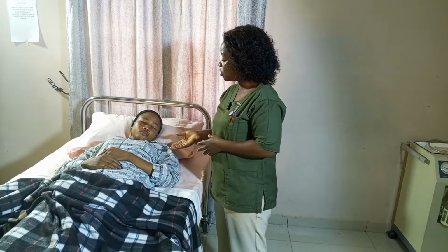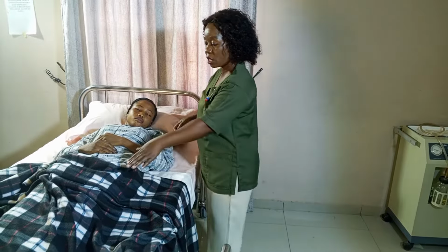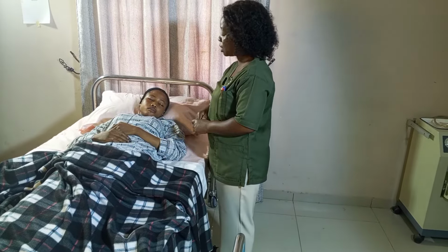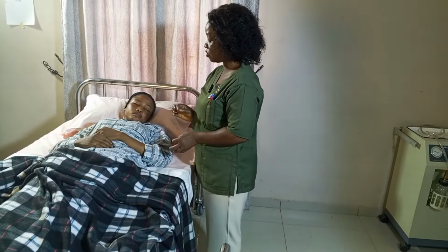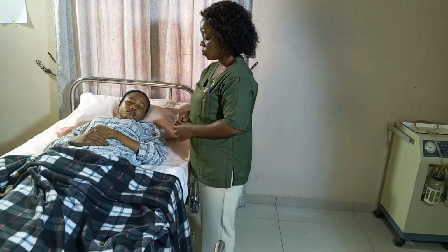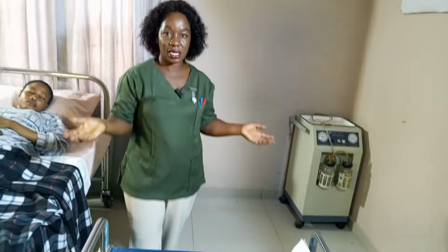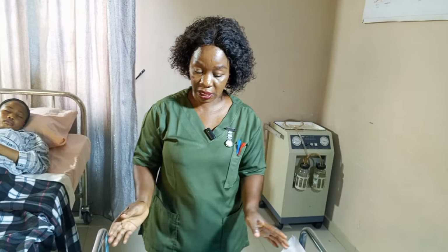So I'm going to give you your prescribed insulin, right? And I'm going to administer it on your thigh. Please, it's not going to be painful, just a slight pinch or sting that you feel, right? So can I go ahead? Okay, now that the patient has agreed and consented that I should administer this medication, I'm going to prepare my medication, right?